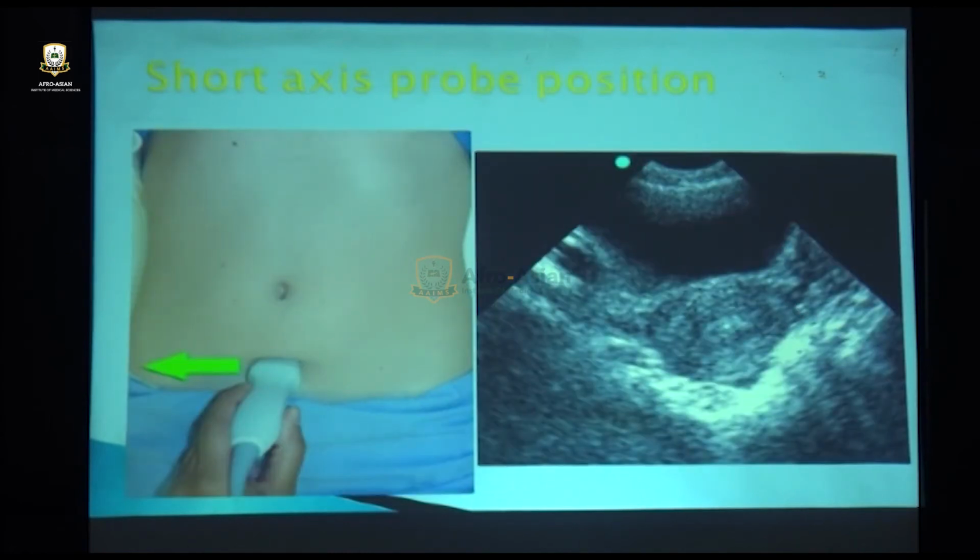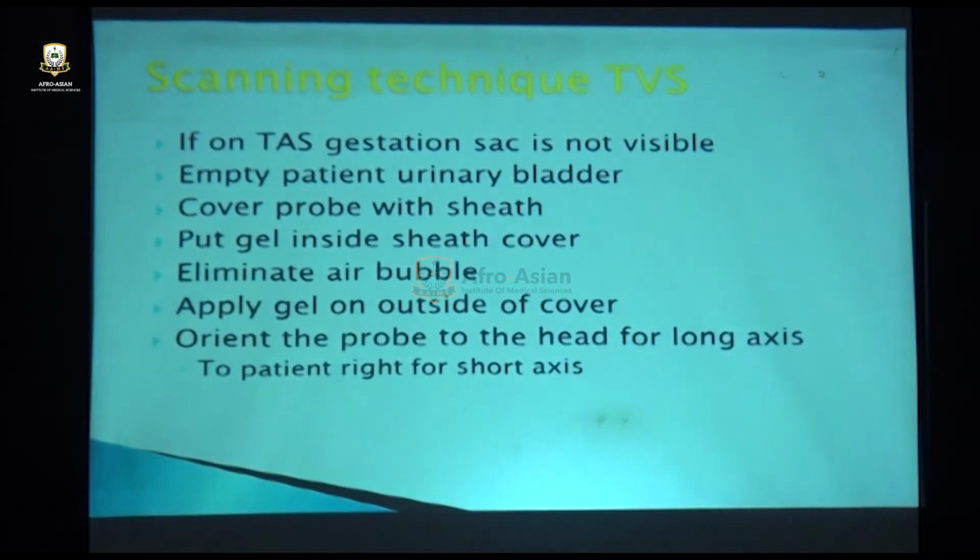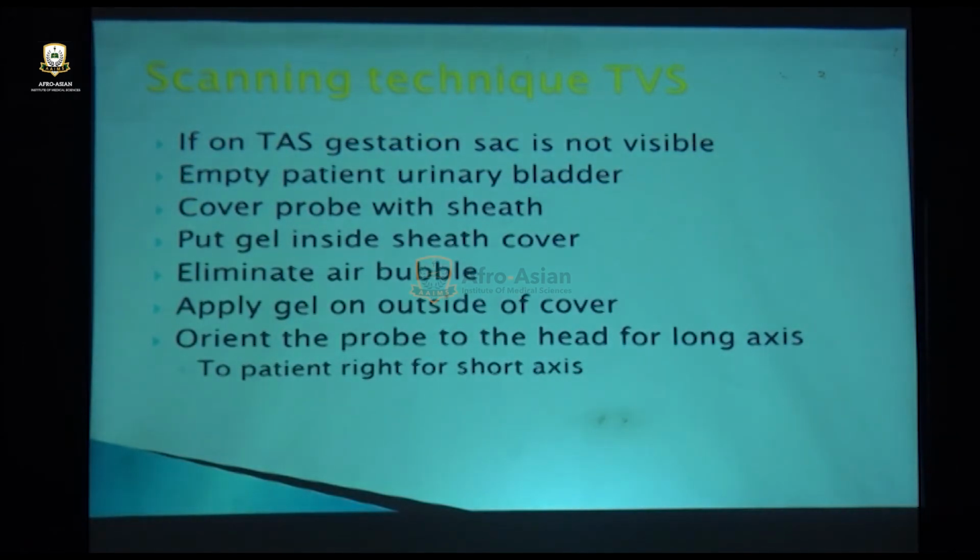Transverse में you'll see on the left there is the placement of the probe, and on the right you have the transverse section of the uterus. Scanning technique of transvaginal scan. This gets you closer and eliminates air bubbles.